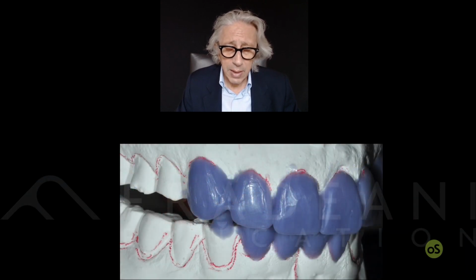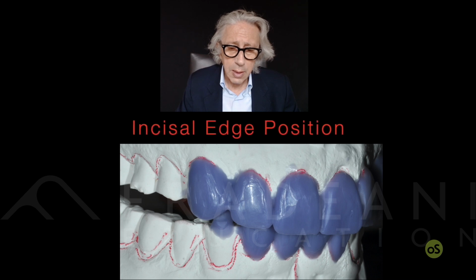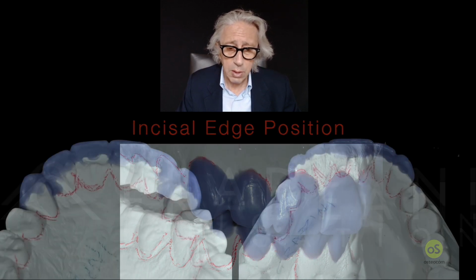We have started, or better to say, our dental technicians started to build up the anterior sector as the first step. Once you have received from the clinician all the information on how much to increase the vertical dimension, how much to increase the length of the upper and the lower, at this point you create a space for posterior teeth. So the first step will always be the determination of the incisal edge position. I could say positions because I'm talking about upper and lower, of course.